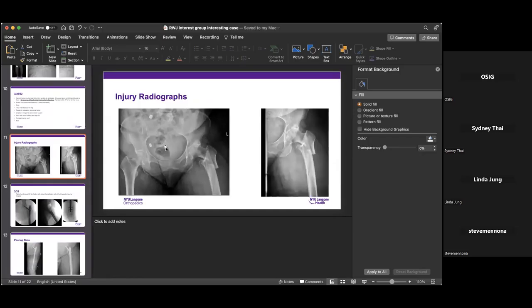Yeah, I mean, if I did a total hip with this fracture, you could do it, but this comes back to your anatomy. Her greater trochanter, this is like a subtrochanteric fracture. If I wanted to put a total hip replacement in her, this part of bone has to be functional and intact to have a well-functioning hip replacement, and it's not healed.